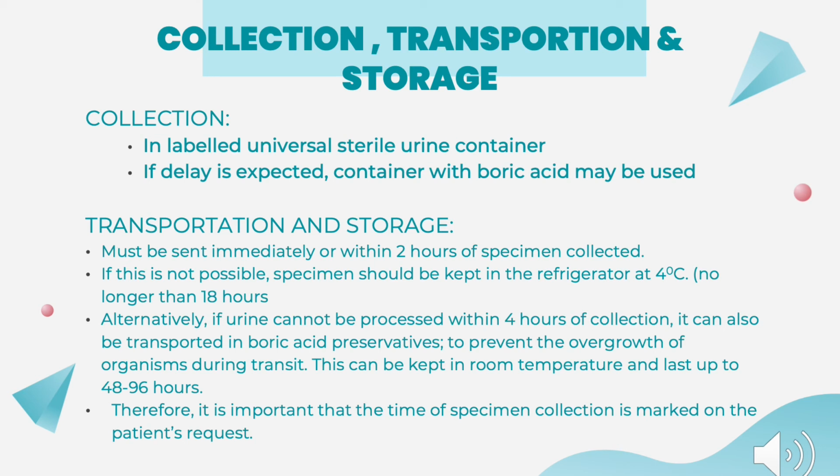If there is any delay expected, it may be transported in a container containing boric acid, which is to prevent overgrowth of organisms during transit. Urine and boric acid must be kept at room temperature and can last up to 48-96 hours.